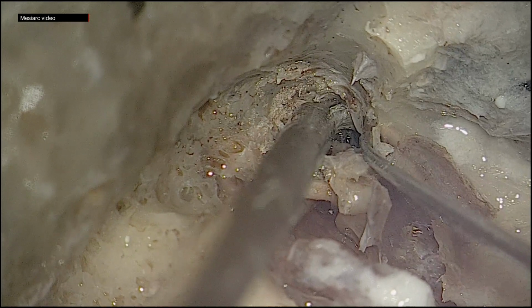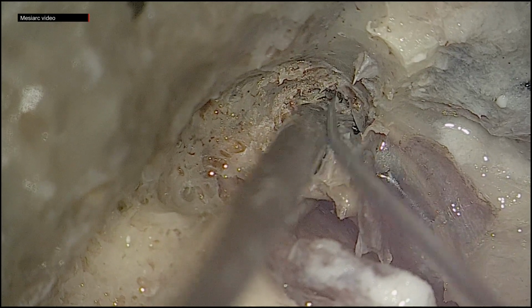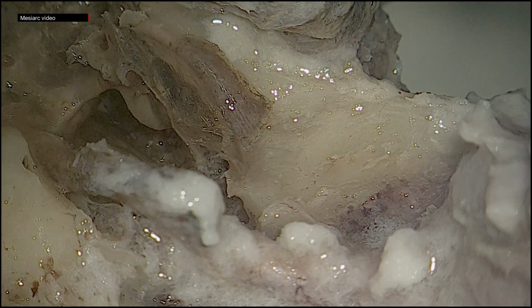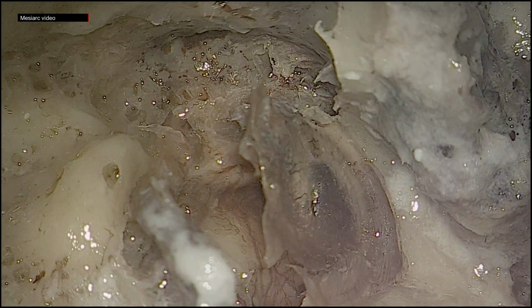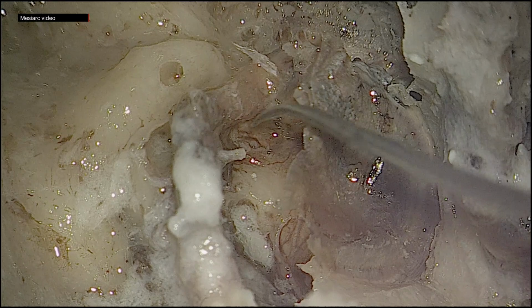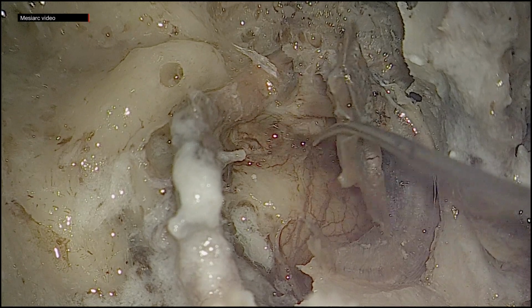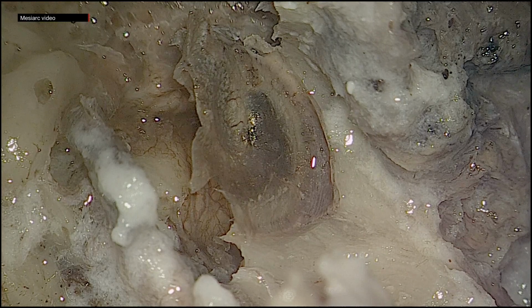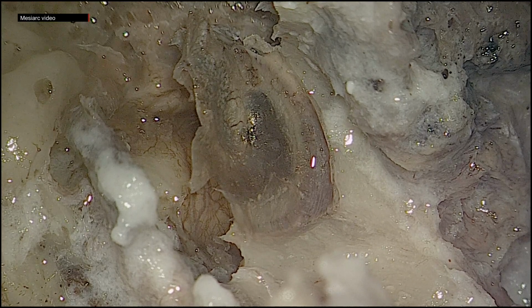Complete canal wall down mastoidectomy should mean that the eustachian tube orifice, into which the probe is going now, which you can see in the picture, and the supratubal recess lie in one plane without any ridge in between. So that is the semicanal of tensor tympani and the remnant of the tympanic membrane. Facial nerve has already been decompressed in the previous exercise.